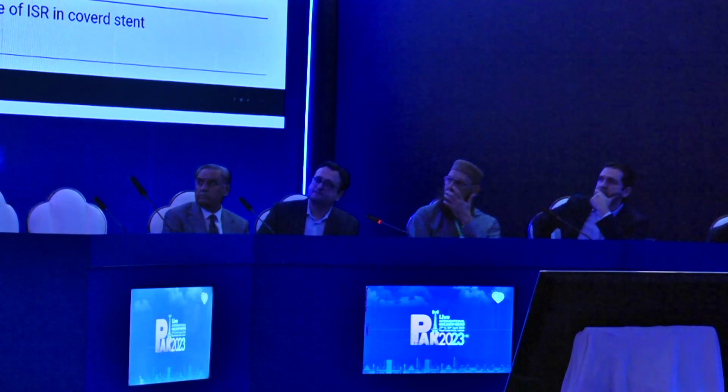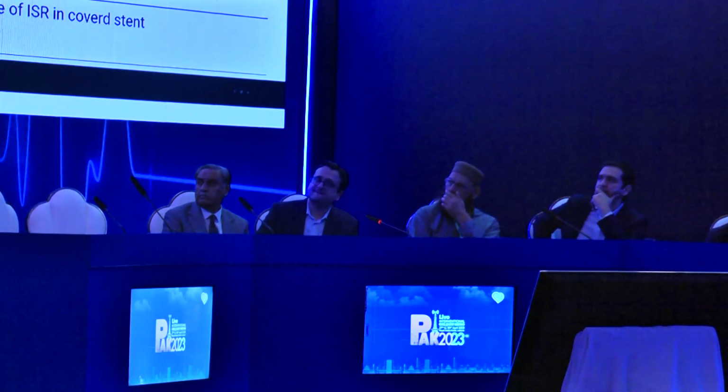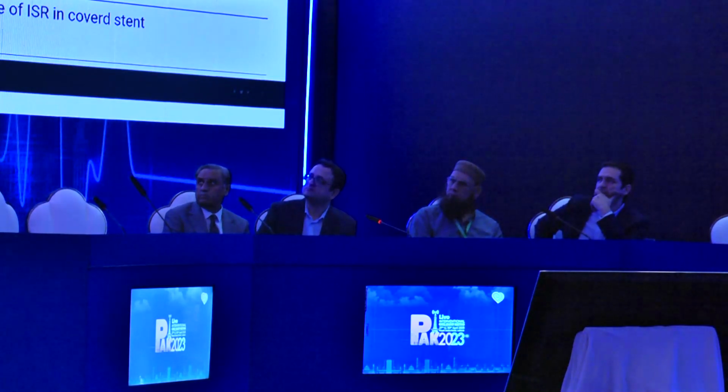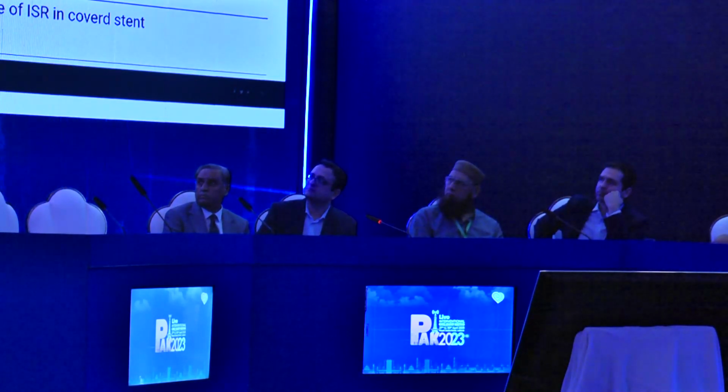It appears that the ostial circumflex is relatively free of disease, but Shami, I don't know if you can comment on the Medina classification here, how involved the bifurcation is. It seems to me you're going to have a strategy of LAD stent back to the ostial left main, and then the way you treat the circumflex will depend on the involvement at the ostium.